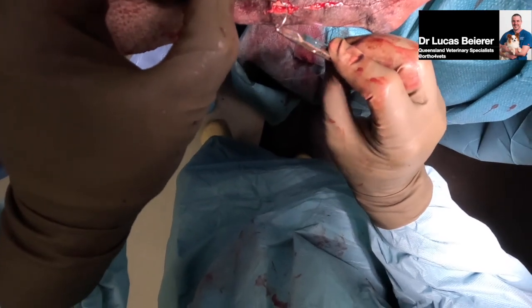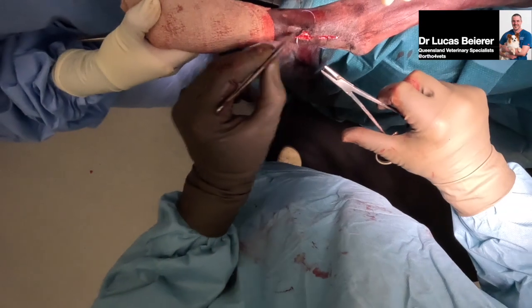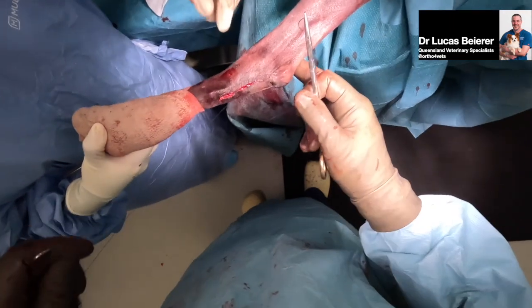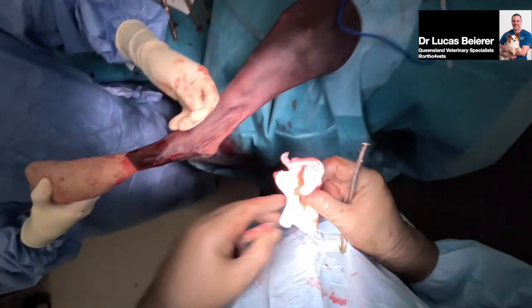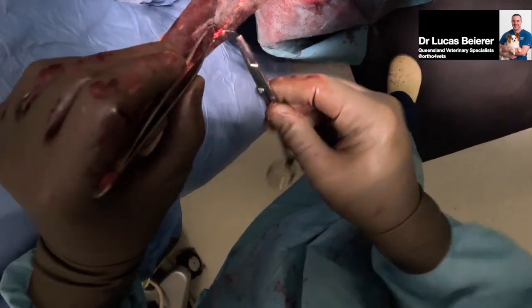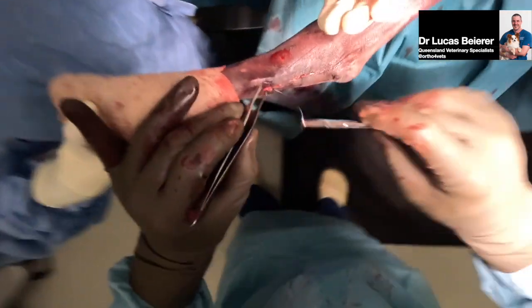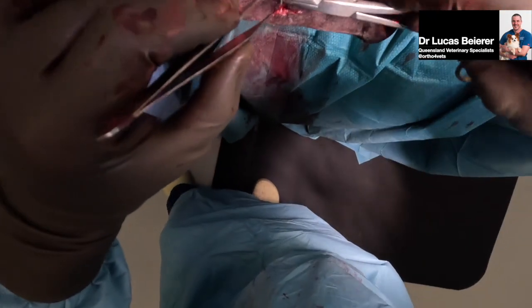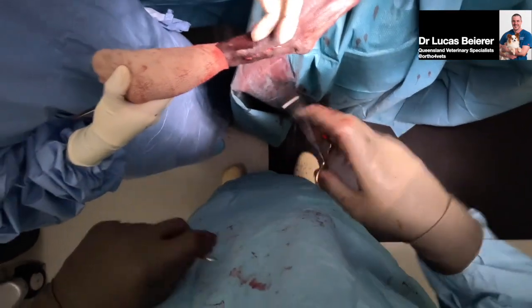Oh, it's getting tight. So, it's one of the advantages of not having the skin incision down the bottom end of the plate. Get some 4-0 skin, please. A little bit tight, but very reasonable, I think.